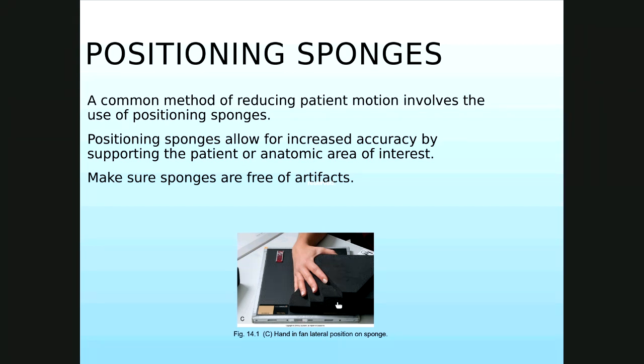They do make sponges that have coverings that are able to be cleaned. We do have some of these in the lab. If you check those out, they're green. I will tell you that that covering that is able to be cleaned does leave artifact on the image, but that would be a potential that you could use. But most of the facilities that we use for clinical sites tend to have thrown all their sponges out and not ordered more.